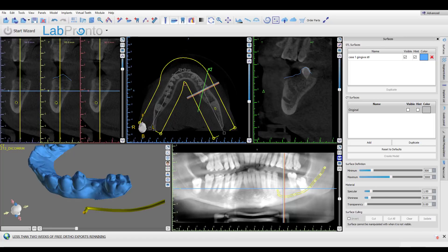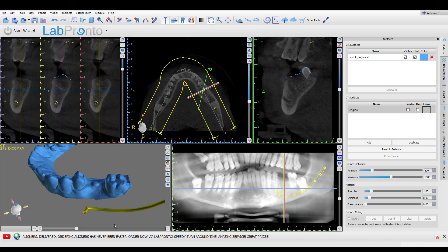Hey, this is Dr. Corey Glenn and I'm going to show in this video how to use Blue Sky Plan for an implant that may not necessarily be listed in the Blue Sky software.